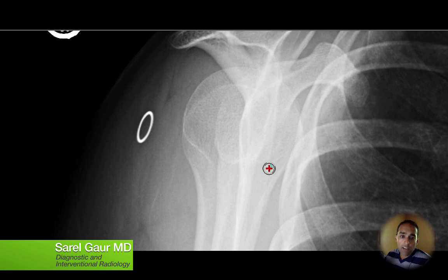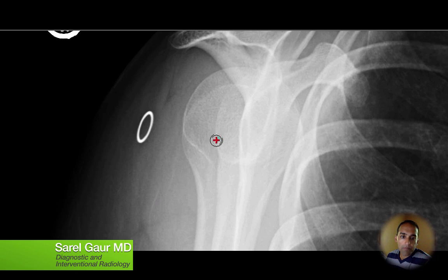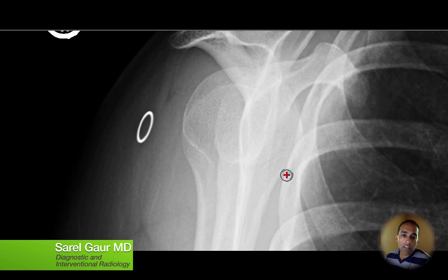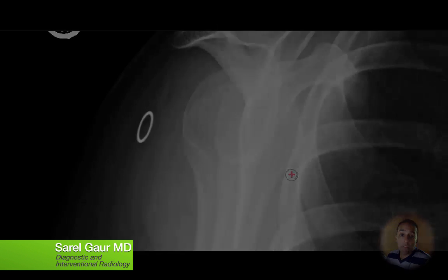That oval structure is actually the glenoid, being viewed en face — basically staring straight at it like a bull's-eye. And I can see the humeral head is completely overlying that glenoid. So this is again further proof that the humeral head is in direct contact with the glenoid, and I can confirm there is no dislocation of the humeral head. There is an anatomic glenohumeral position.